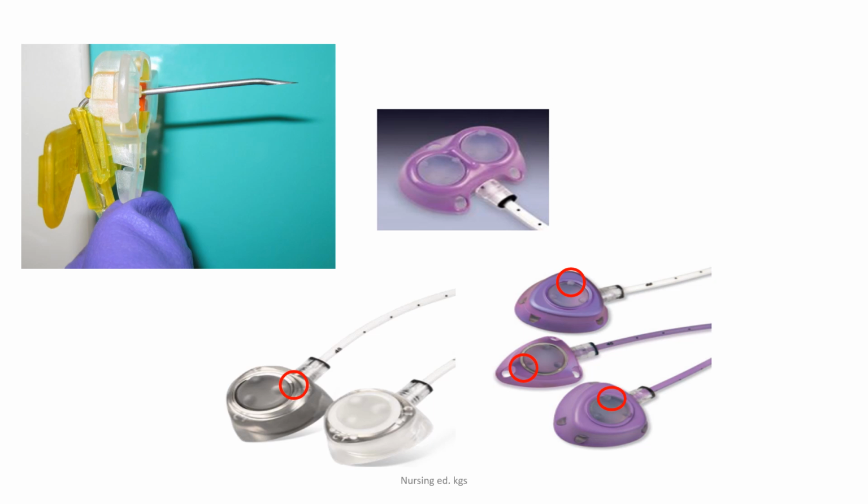They can be used for medication administration, such as chemotherapy or antibiotics. They can be used for administration of IV fluids. They can be used for blood transfusion.